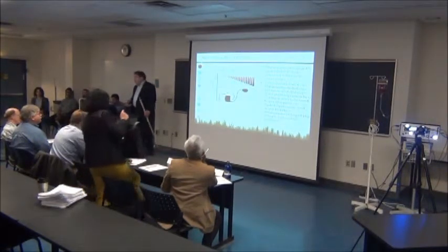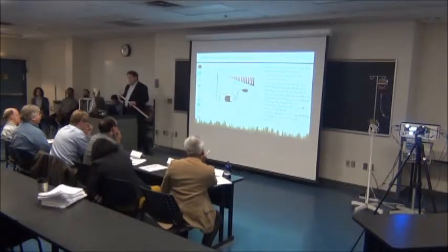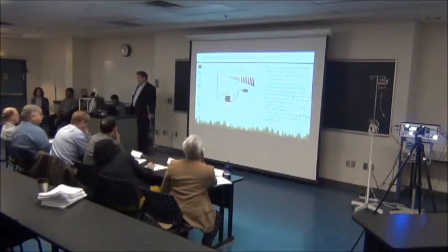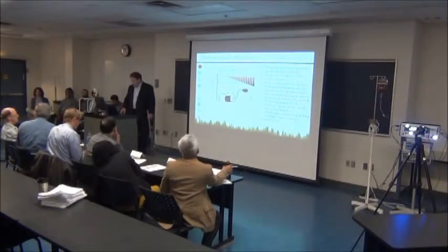Non-invasive blood pressure. We are all familiar with getting our blood pressure taken non-invasively. The clinician can't see the waveform, but can tell by sound through their stethoscope when to take a measurement to get the peak or systolic pressure, and when to take a measurement to get the trough or diastolic pressure.